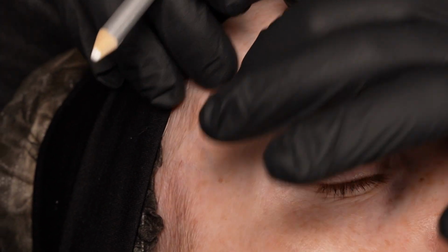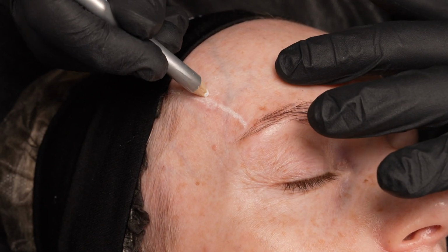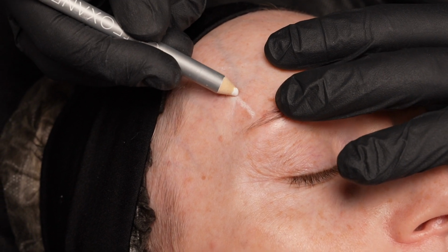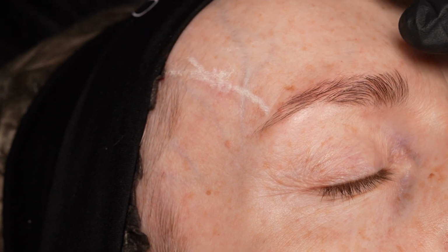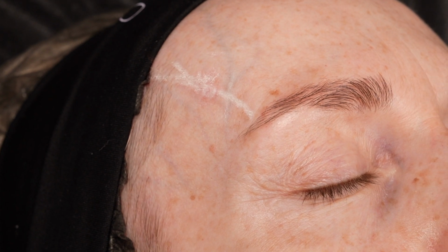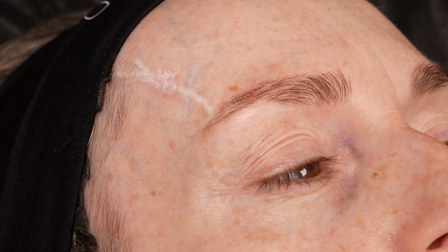But for example, this is a crest. Stay a little bit back from the crest, and then check the veins. If, for example, here's the vein, here is the vein, and open your way from here. Okay? On the bone side, because the crest is a limit between the temple and the forehead. And this limit, all tissues, the temple layers, end at this crest.